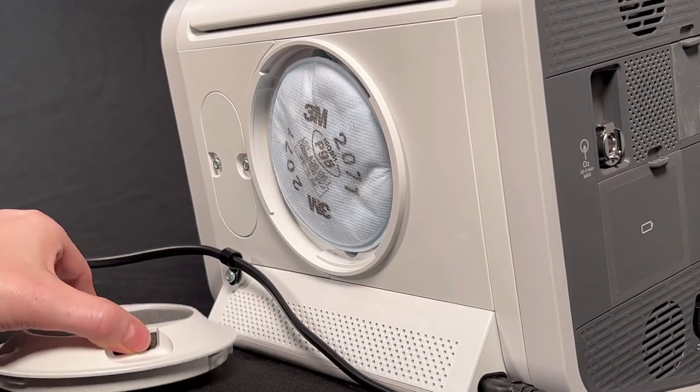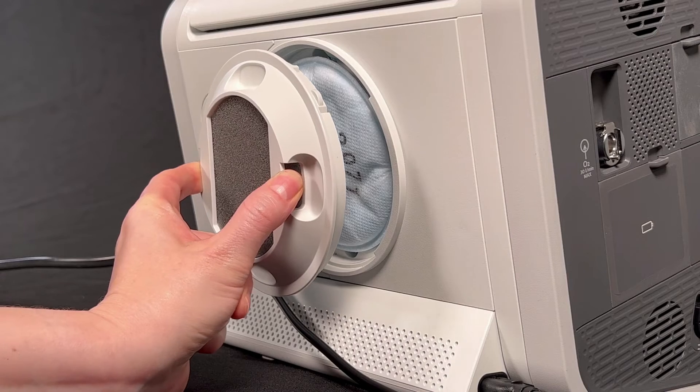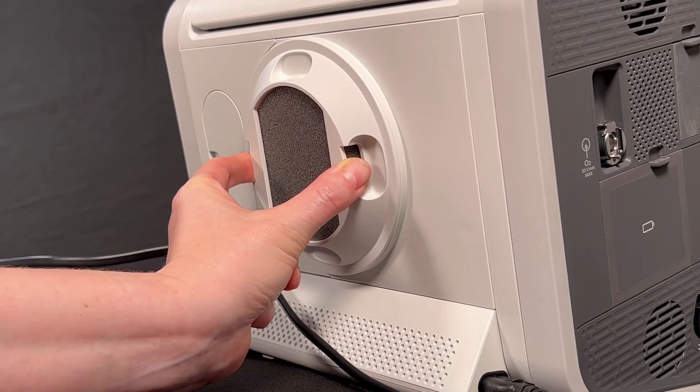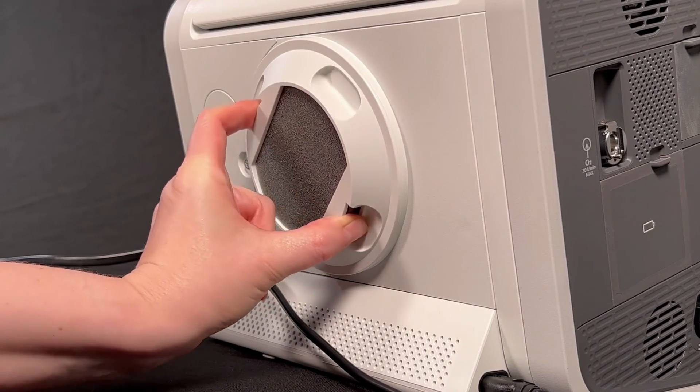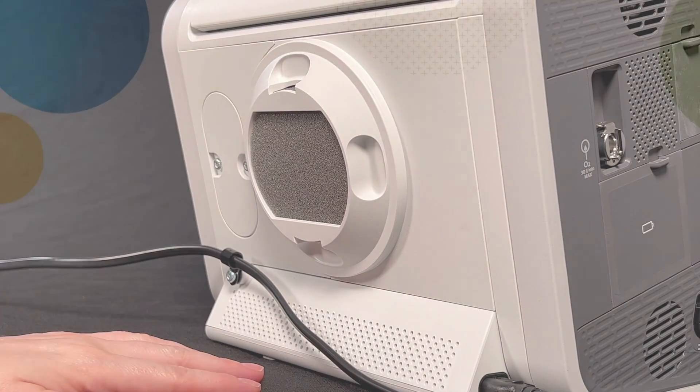Put your finger and thumb in the notches of the filter cover. Hold it so the black foam filter is in an upright position. Insert the filter cover into the opening on the back of the Trilogy Evo. Twist the filter cover a quarter turn to the right until you hear it click into place.